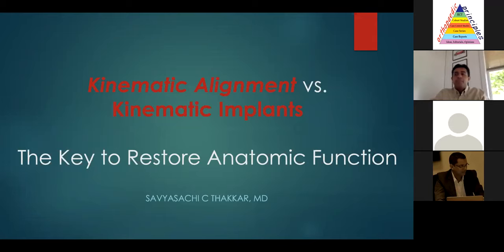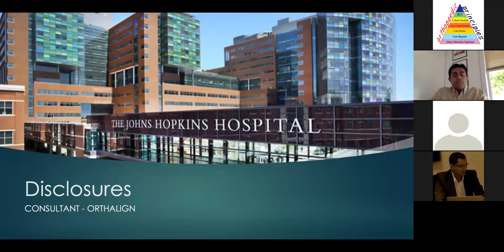Once again, as Hitesh mentioned, I work at the Johns Hopkins Hospital in Baltimore. And my disclosure relevant to this talk is that I'm a consultant designer for OrthAlign, which is a portable handheld navigation system. It's a small console navigation system that allows you to place knees and unis either in a kinematically aligned fashion or mechanically aligned fashion.